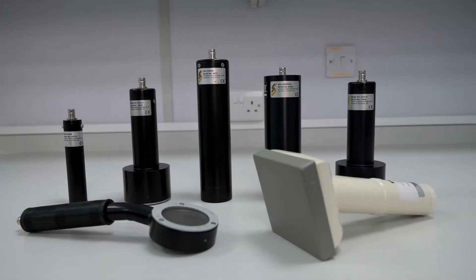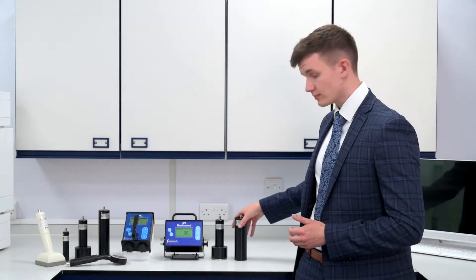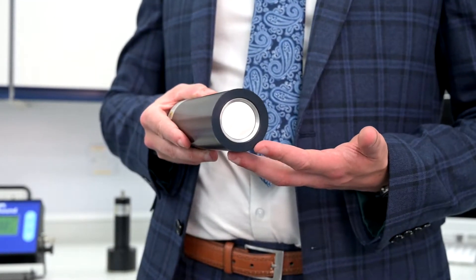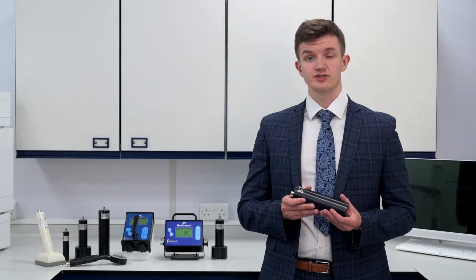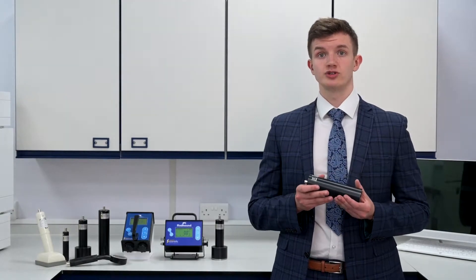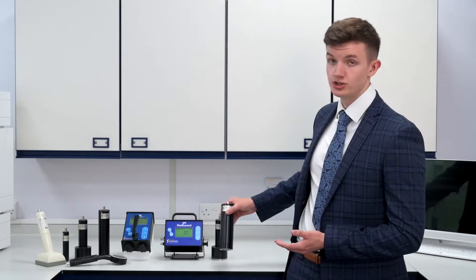We offer a wide range of contamination and dose rate probes to suit every application. For example, the SS404AL. This probe uses a thin sodium iodide crystal with an internal lead collimator, allowing you to measure gamma energies between 15 keV up to 250 keV, while also reducing background counts. This is the perfect probe for general nuclear medicine use.